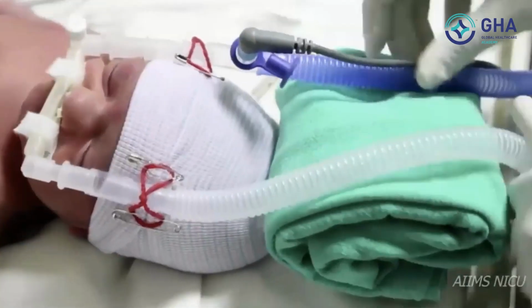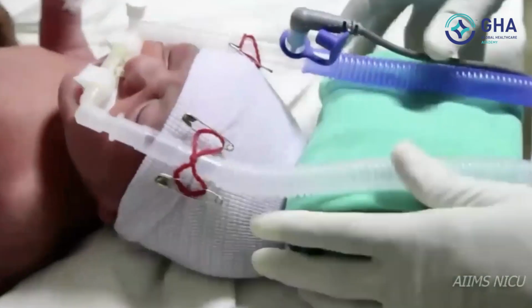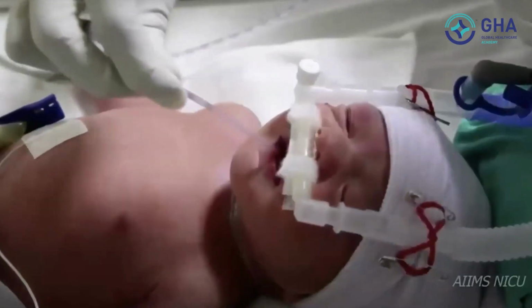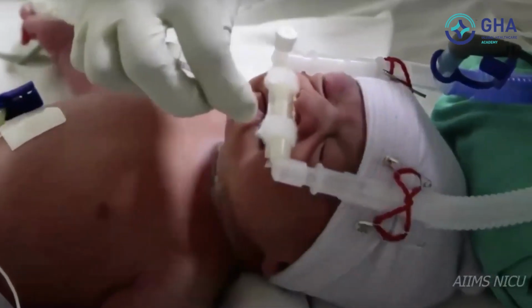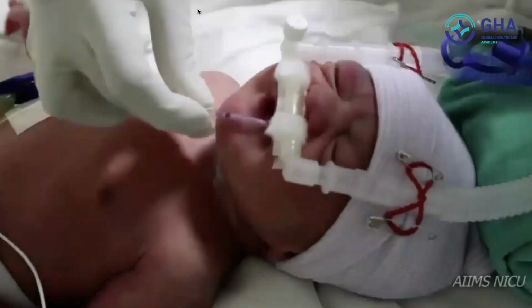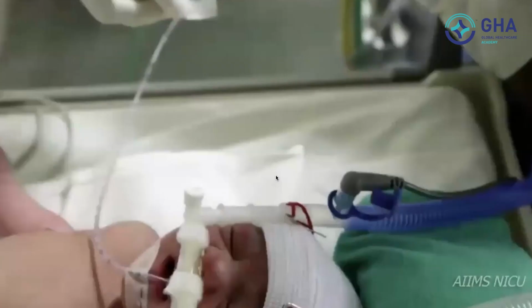Now give support to the tubings by placing a green sheet under them. Insert an orogastric tube and fix the end of the tube to the side wall of the incubator. Keep the end of the orogastric tube open.